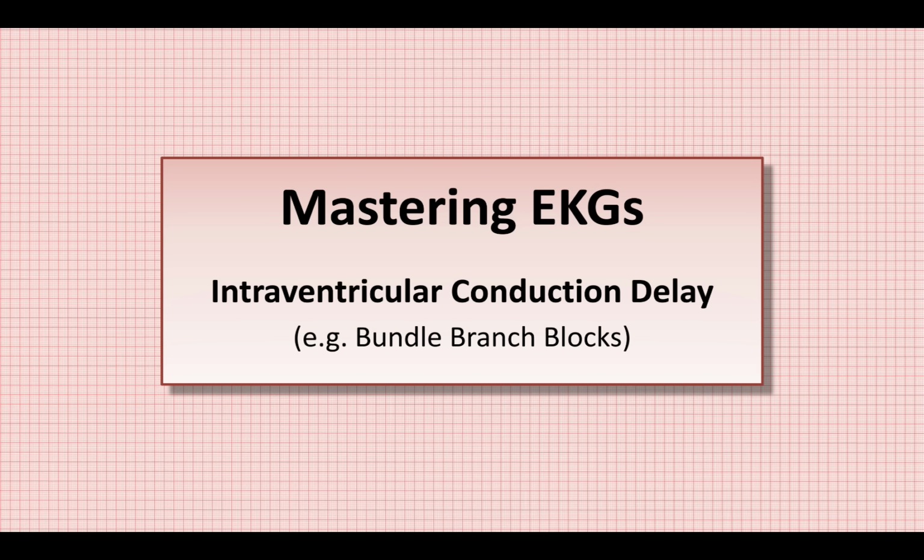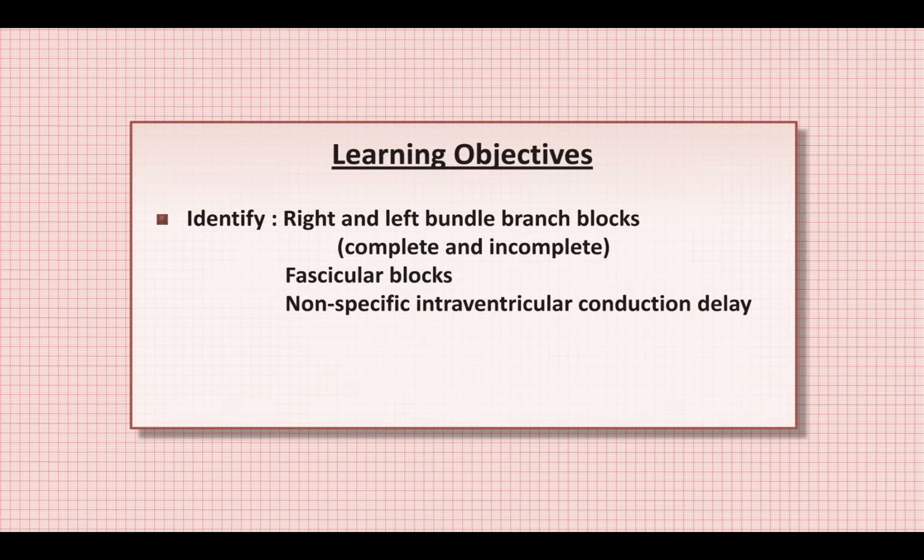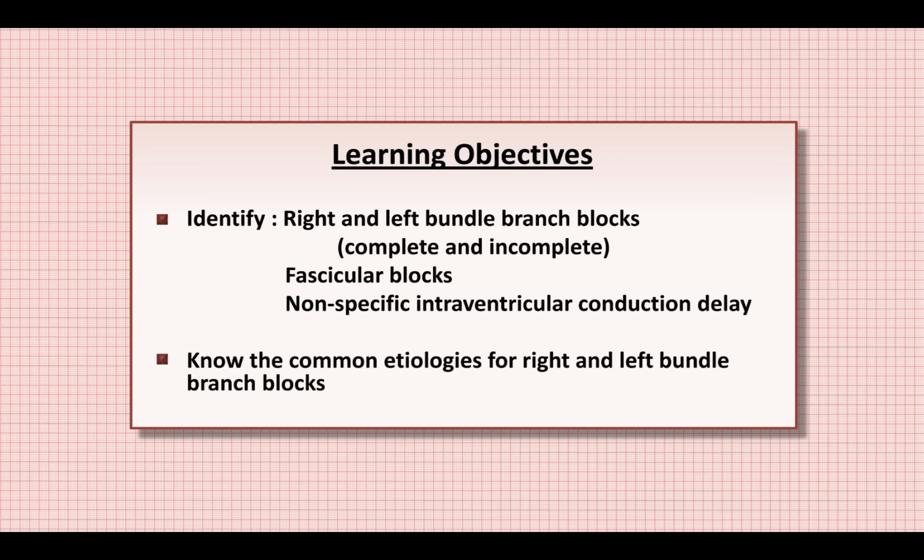Hello, today's topic will be intraventricular conduction delays, which most notably includes bundle branch blocks. At the end of this lecture, you will be able to identify right and left bundle branch blocks and differentiate between complete and incomplete blocks, fascicular blocks, and non-specific intraventricular conduction delay. You will also know the common etiologies for right and left bundle branch blocks.